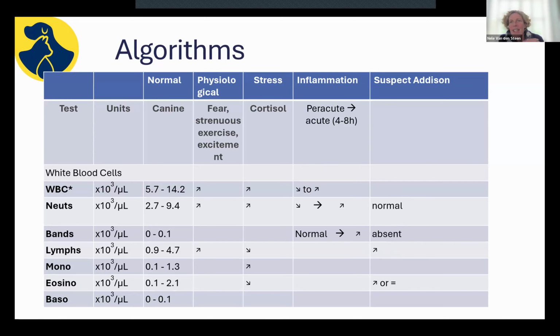Okay, we have seen these present with hypoglycemia, we've seen these present with normal glycemia, we've seen these present with a low albumin, with chronic GI bleed. It is worth just flagging that pattern up. If you get peracute inflammation, your white blood cell count might drop because you're using more, and it takes a few hours for your bone marrow to start increasing this production and kicking those out. Okay.